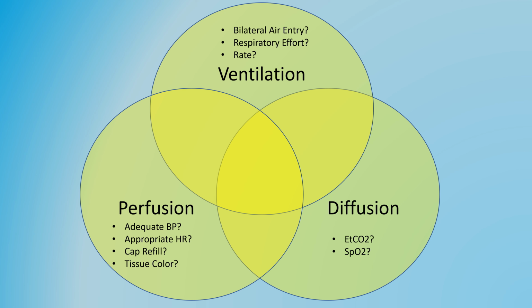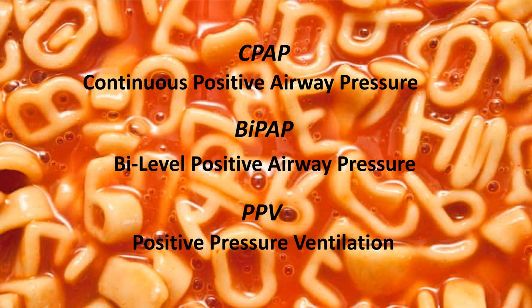Okay, so what exactly is CPAP and why are we using it? As indicated on the title page, CPAP stands for Continuous Positive Airway Pressure. I realize that after a while, all the acronyms start to feel a little bit like alphabet soup, and this can cause some confusion. CPAP differs from BiPAP and positive pressure ventilation in the sense that CPAP is blowing pressurized oxygen at the same pressure consistently, regardless of what phase of the respiratory cycle the patient's in. Think of it like a leaf blower for your lungs.